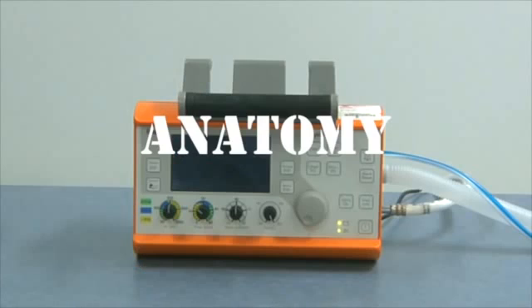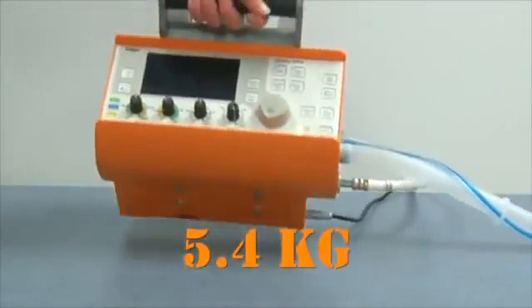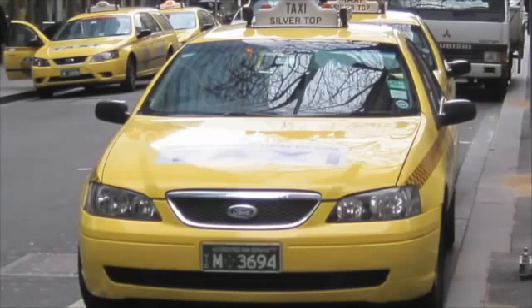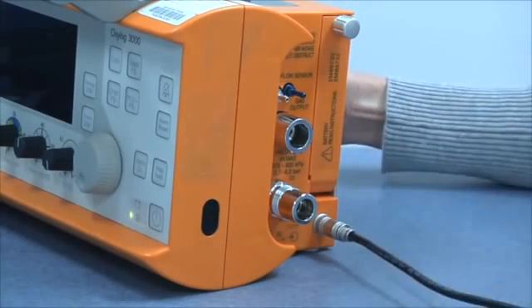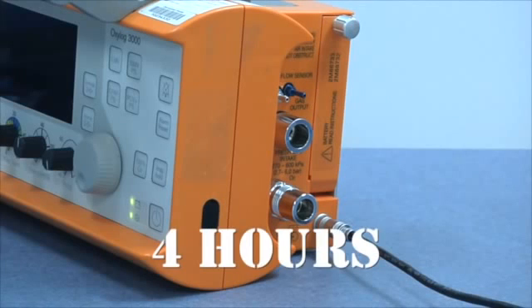First let's talk about the anatomy of the Oxilog. The 3000 weighs 5.4 kilos and costs about $25,000, so try not to drop it on your foot or leave it in a taxi. The machine is electronically controlled but gas driven, meaning it has to have both electricity and pressurised oxygen to work. The electricity supply comes either from the internal lithium-ion battery or from a DC transformer. In normal operation the battery life is about four hours.